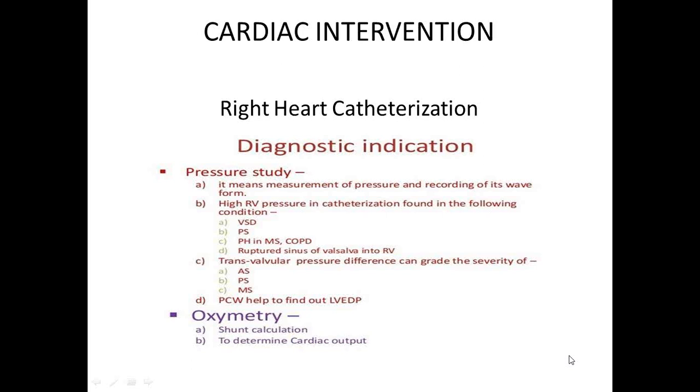So again, good morning. This morning's session is on right heart catheterization. And what we mean by right heart catheterization is we put a catheter in the right side of the heart. And we can do a number of things when we have a catheter in the right side of the heart.